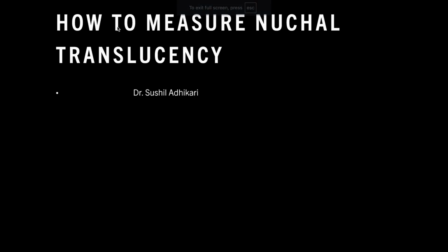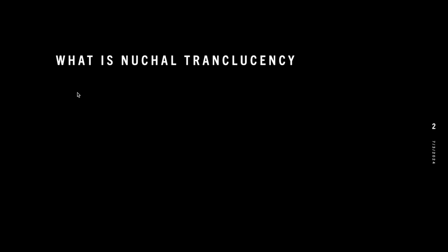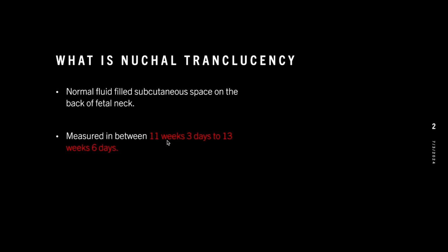Hello everyone, in today's video we are going to discuss how to measure nuchal translucency. So what is nuchal translucency? Nuchal translucency is actually a normal fluid filled subcutaneous space. So it is a fluid filled space on the subcutaneous plane. It lies on the back of the fetal neck. It is measured between 11 weeks 3 days to 13 weeks 6 days.